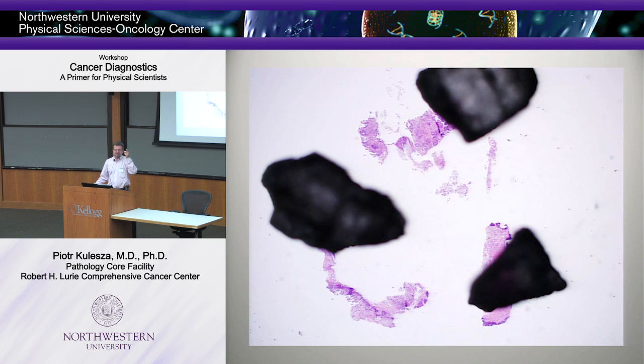So then what is that? I took salt, put it on the stage of my microscope on the glass slide, and took a picture. So this gives you a reference point about how tiny lung core biopsies can be and what is really required of that tissue to produce all the spectrum of molecular diagnoses to be sufficient for this assay, that assay, my diagnosis, etc. Okay? So this is just a perspective. I mean, admittedly, these grains are fairly large. I was biased and picked the big ones, but it gives you a size reference.